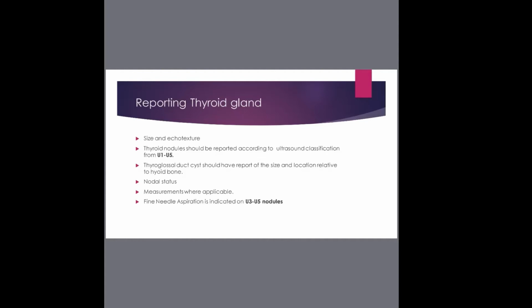Even for PET CT, they can pick up a nodule that might appear hot, like a hot nodule, but they still come down to ultrasound to classify. So ultrasound classification is actually the gold standard, which is why it is very important to know how to report and classify those nodules.